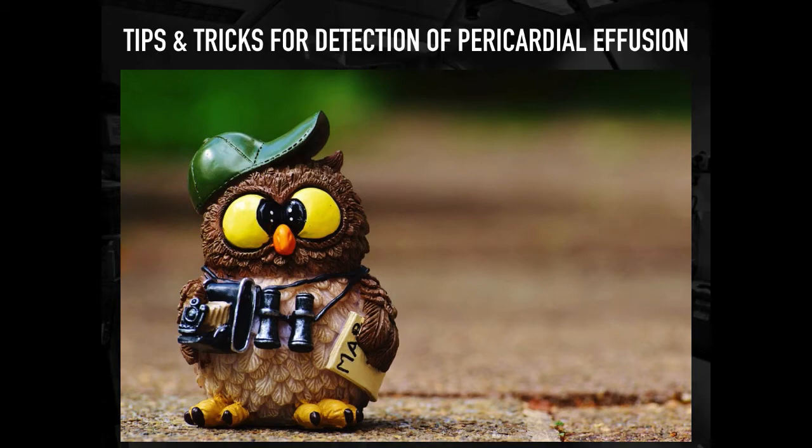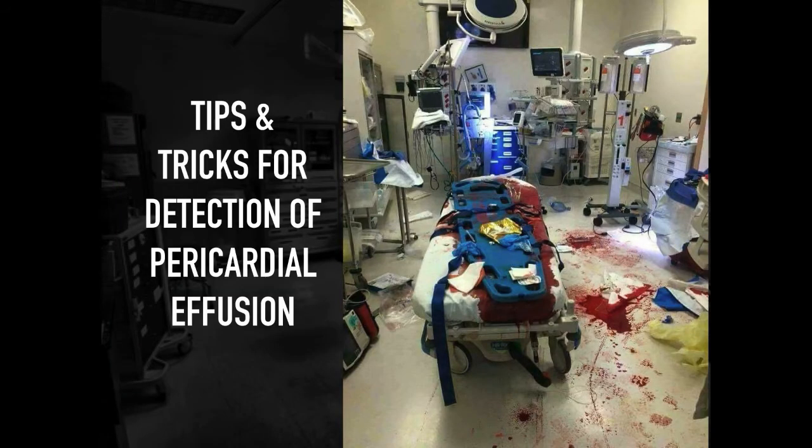by these trivial effusions. The clinical history is important, as patients with chronic illness such as chronic kidney disease or hypothyroidism may have asymptomatic or occult pericardial effusions that occur prior to trauma. It is difficult to say whether these effusions are truly acute relating to traumatic illness, but should likely be treated on that suspicion. Furthermore, comprehensive echo is likely required regardless, as patients with blunt penetrating chest trauma may have other abnormalities such as regional wall motion abnormalities and valvular abnormalities, and structural abnormalities like aortic tears. So it really requires the clinical context for interpretation.